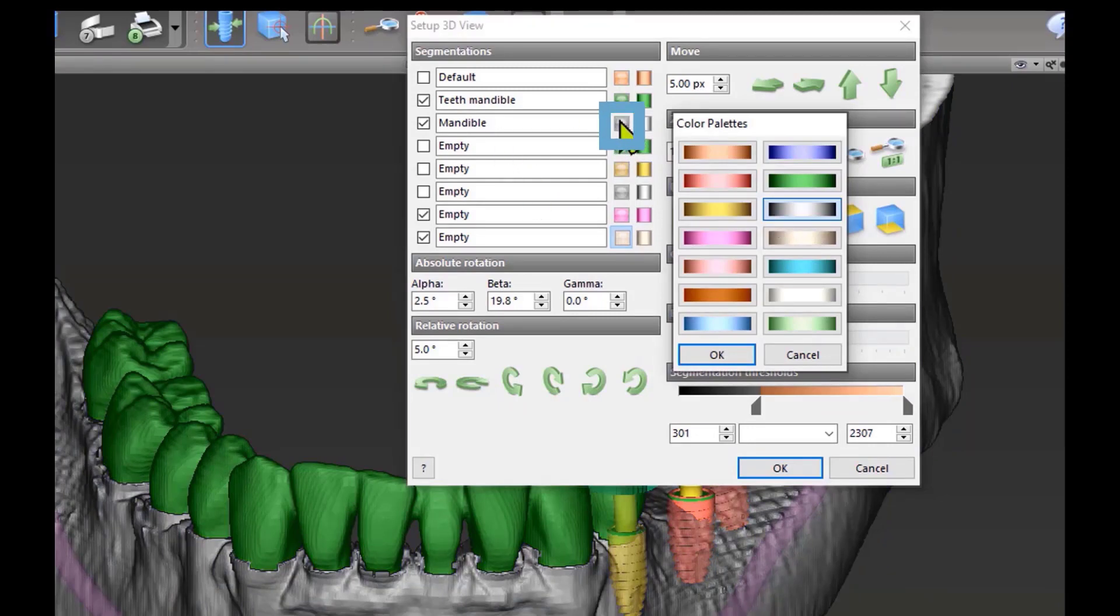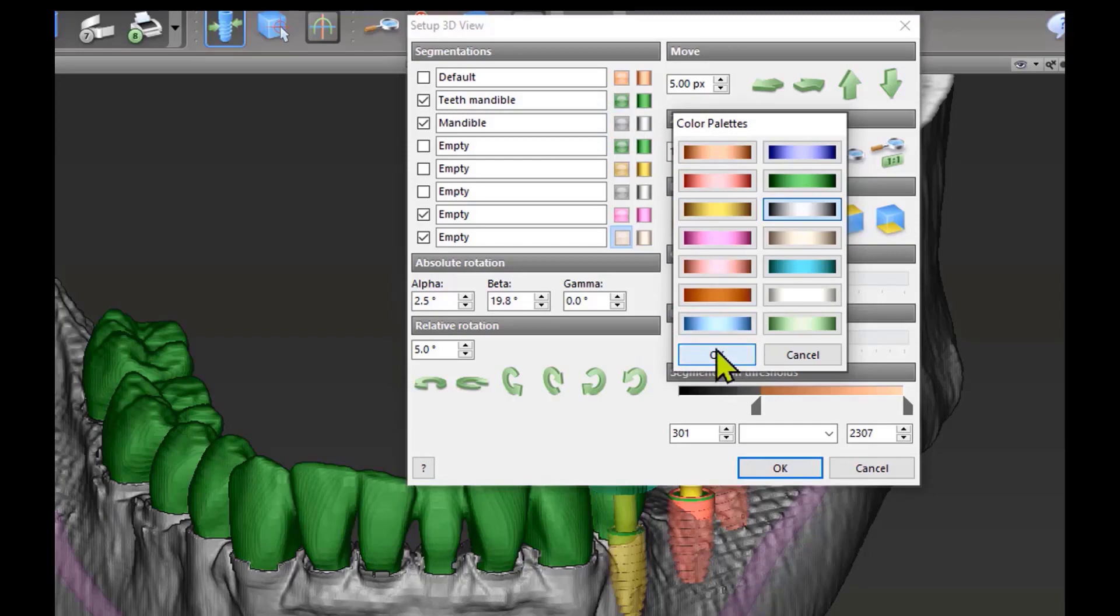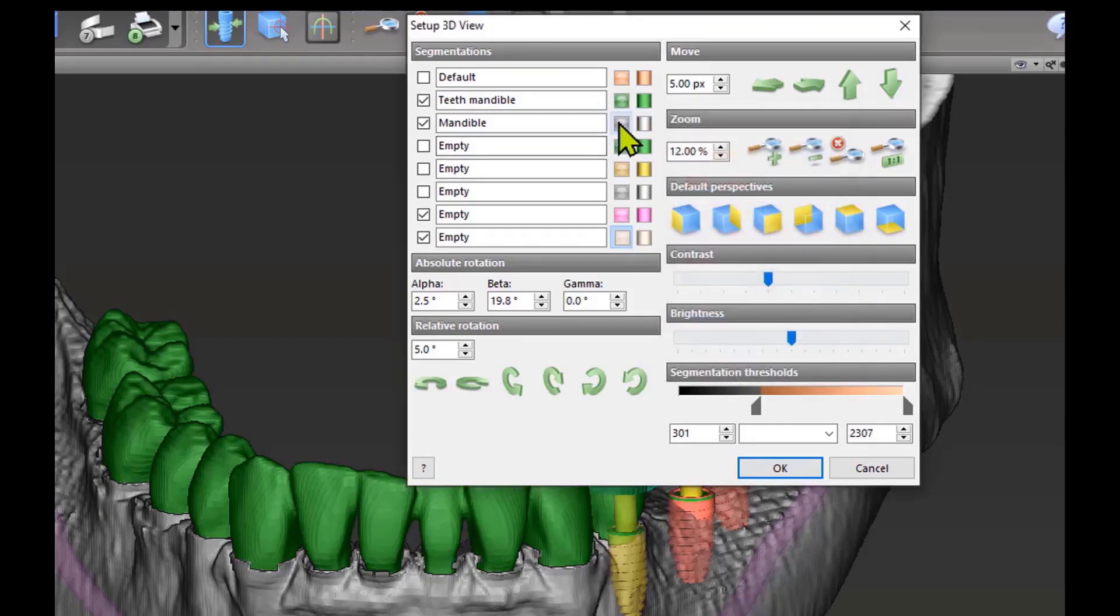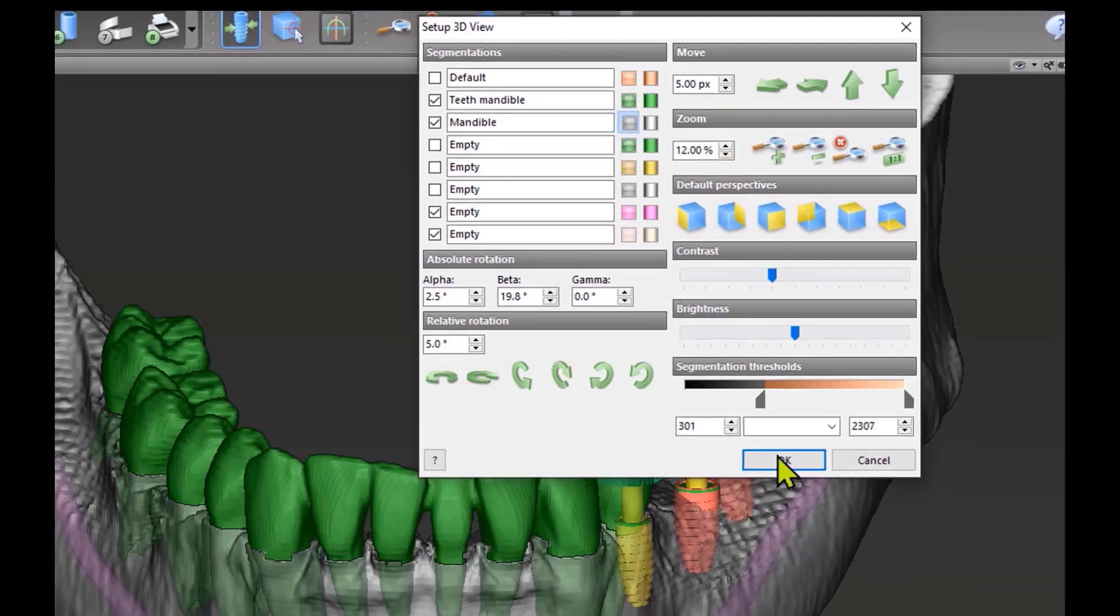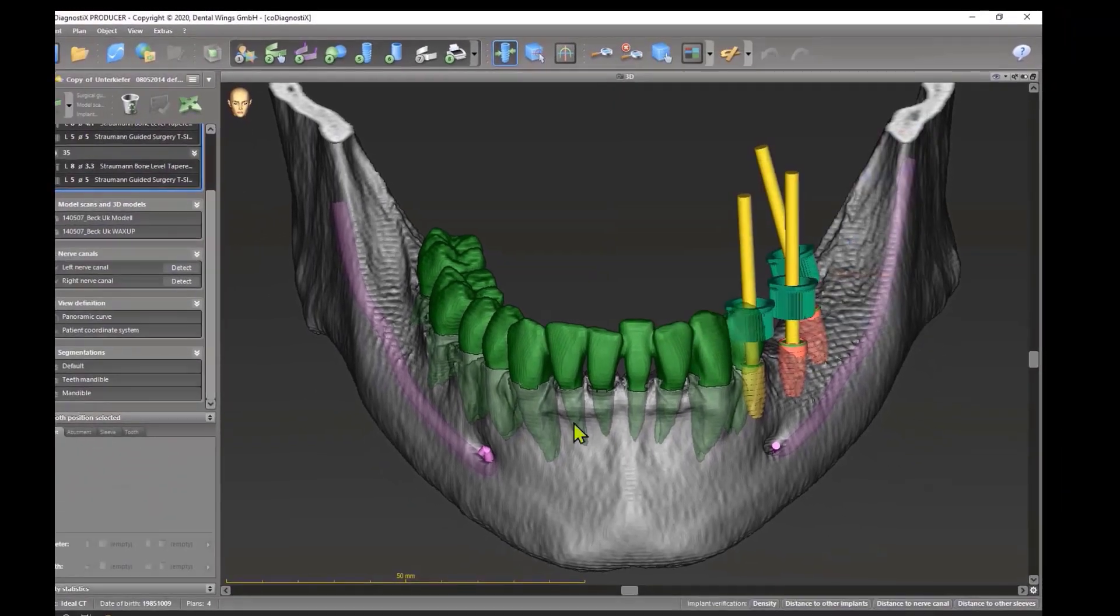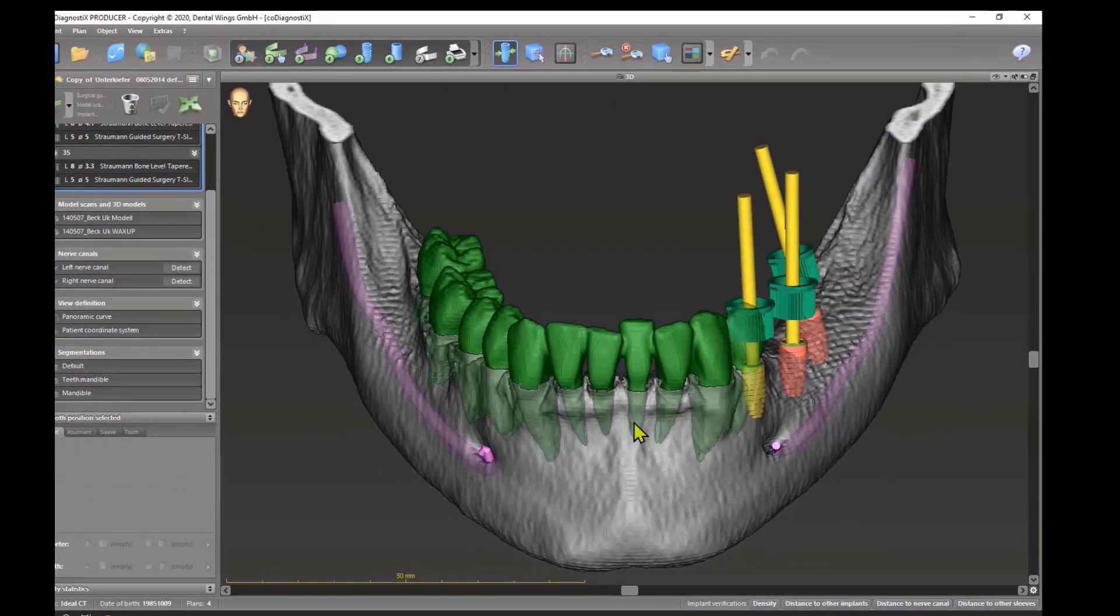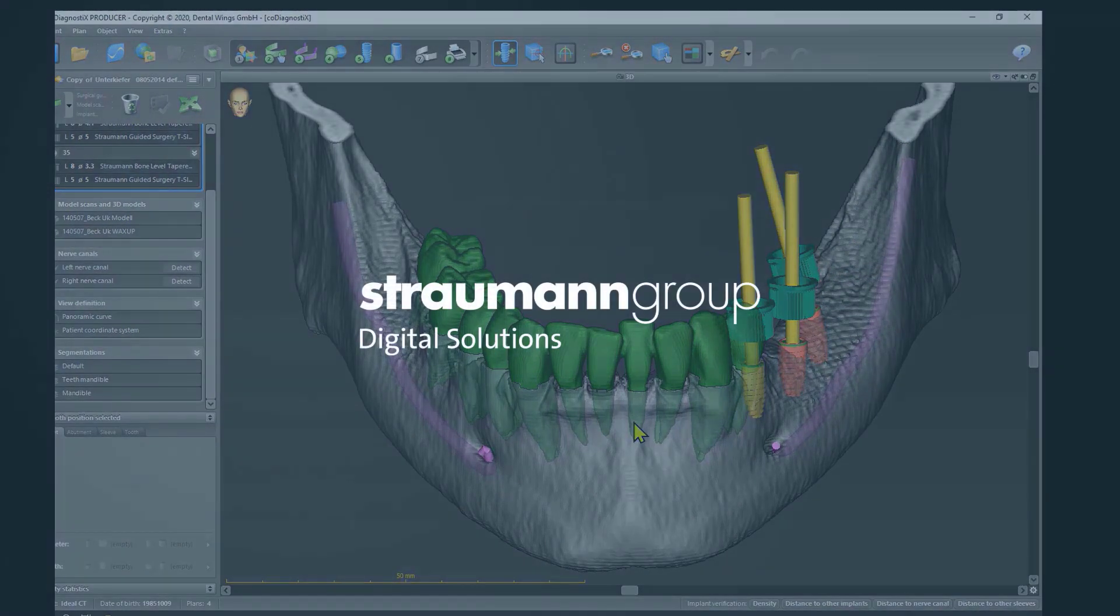If you go on this small button in the middle, you can even get this transparent. And if you do this, see, you can see the teeth through the jaw, which is a really nice picture.